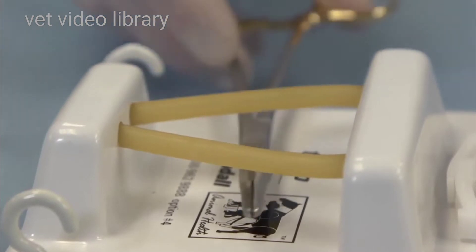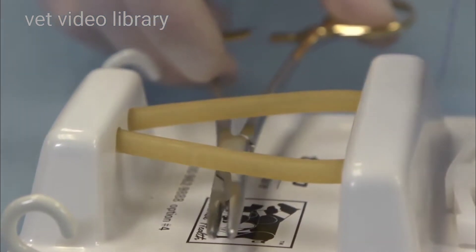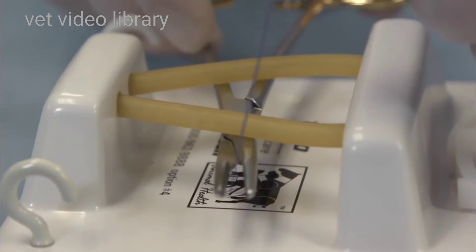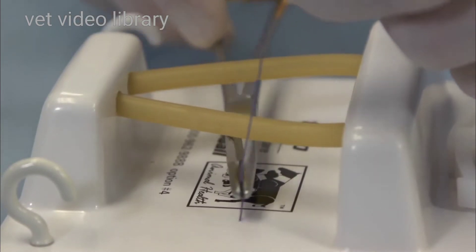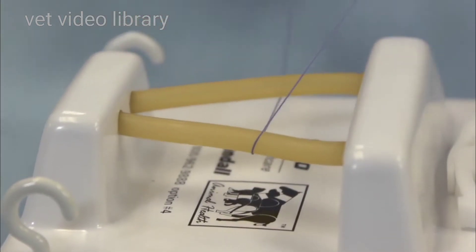When I ligate, I'm going to place my needle holder across the tissue, I'm going to grasp my suture and pull it across like that.